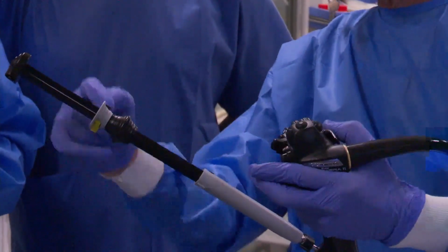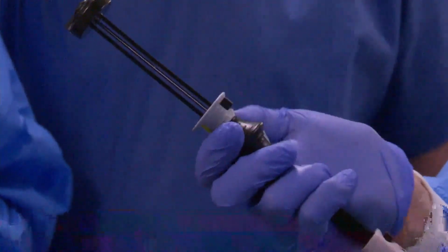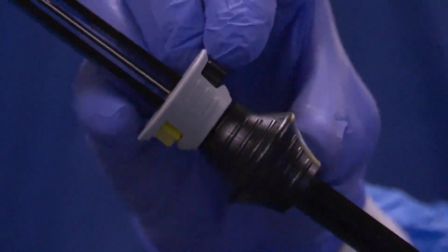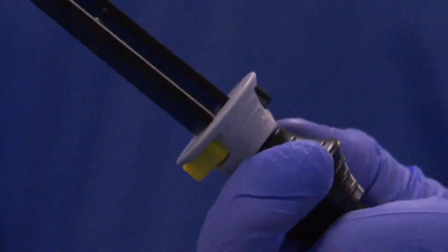So the first thing I'm going to do is now I'm going to look at the EUS. I'm going to unlock, and I see the number 1 pointed down. I see that the gray hub is coupled with the black hub. The two are coupled. You can see that with this yellow pin here. So that couples the two together. So when I advance forward, I'm advancing the sheath forward. And now on the EUS, I'm going to look for the tip. You see the tip now?